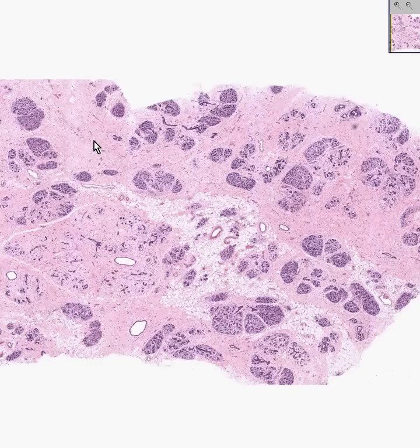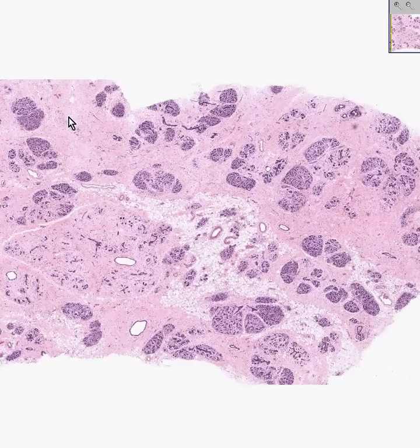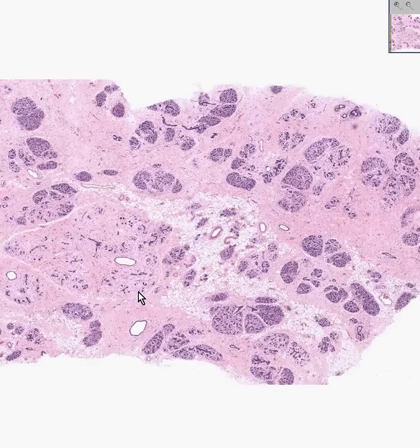All of these areas which are basically pink are connective tissue called stroma. There's stroma, there's stroma, there's stroma.